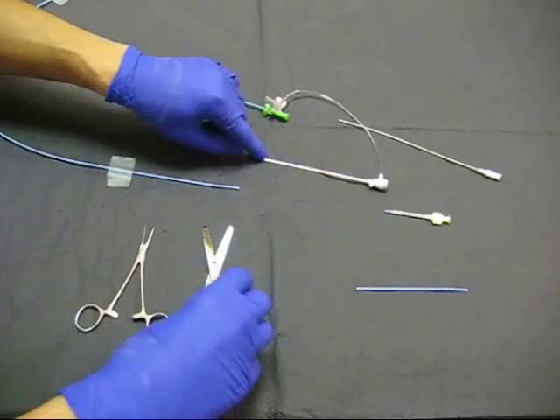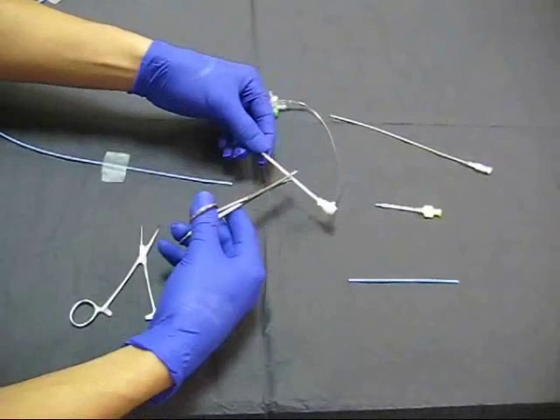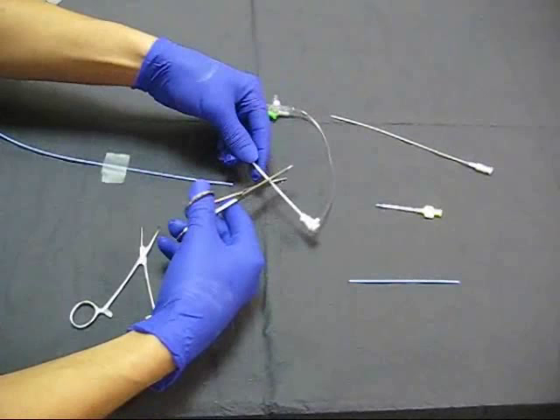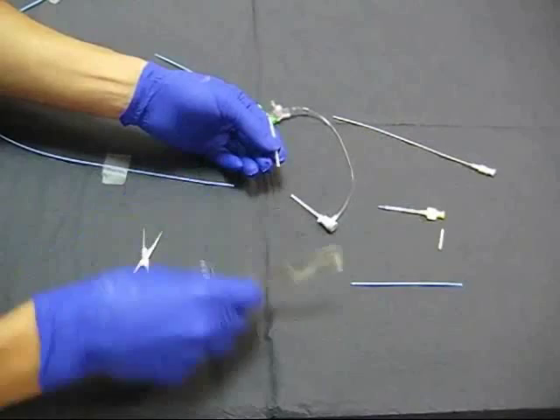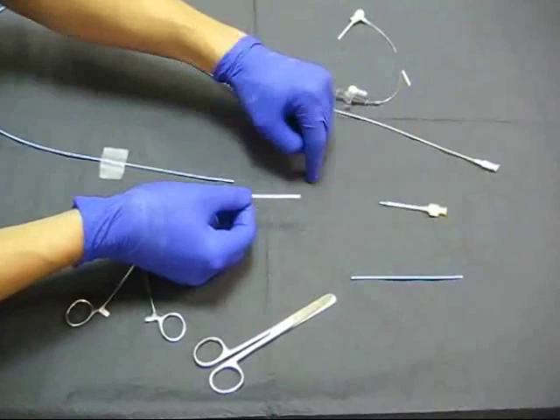What we will do is cut a portion of the sheath and remove the distal tapered part. We are going to use this portion of the sheath to connect the two parts of the guiding catheter.